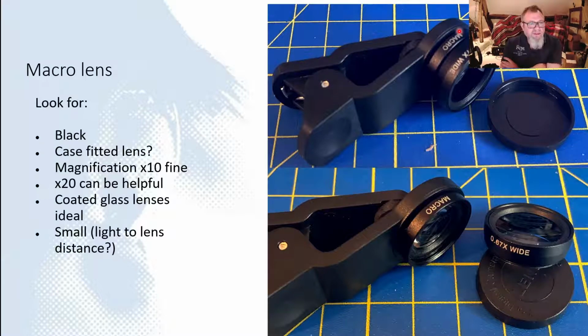When you go to get your macro lens, if you want a black one by choice, there will of course be fewer reflections. You can get them built into the case, which is very useful. Times 10 magnification is fine for most things. Times 20 can be useful, but at times 20 you get such a narrow depth of field it can be quite hard to use. If you've got a coated glass lens, that also means you'll get fewer reflections, and you want a nice small lens if you can, so that you can still use the camera light.